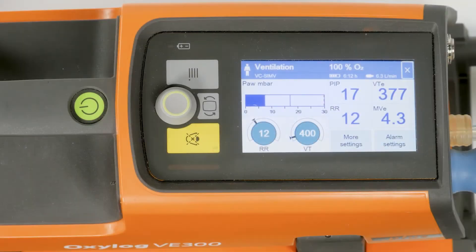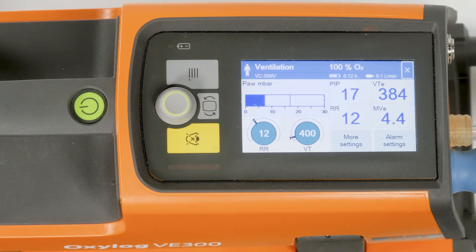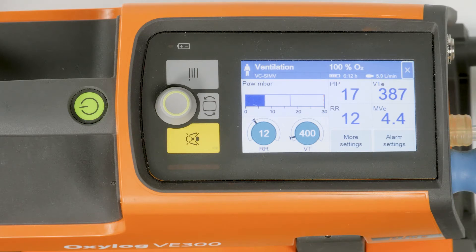The device assigns priorities to the alarms. An alarm always consists of an alarm message and an acoustic alarm signal. The alarm message is highlighted with the corresponding number of exclamation marks.